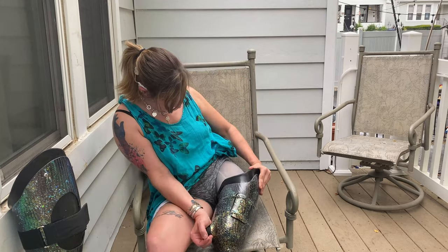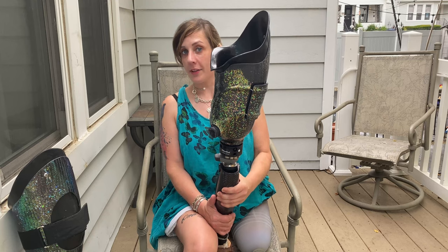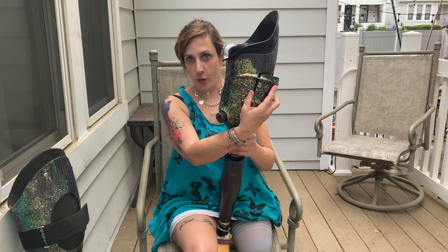Recently, I got a new BOA socket and I want to show it to you. This is a BOA socket. It's got a button here, string and panels, and it's used to assist with volume fluctuations in your residual limb.